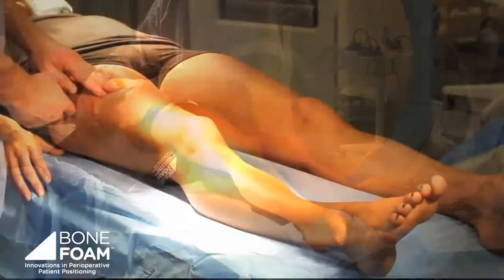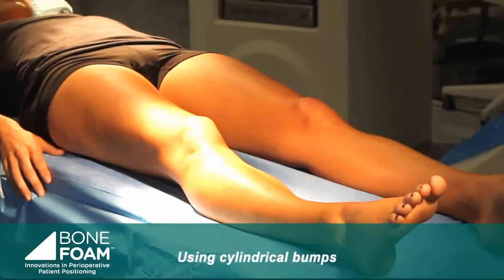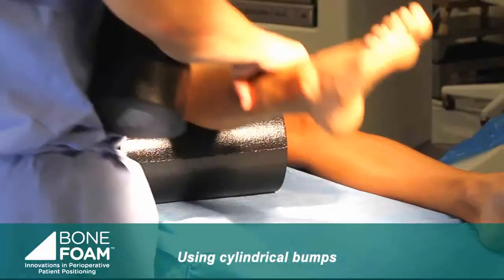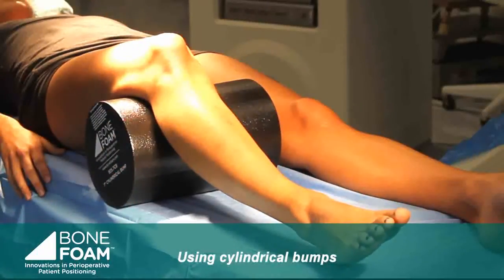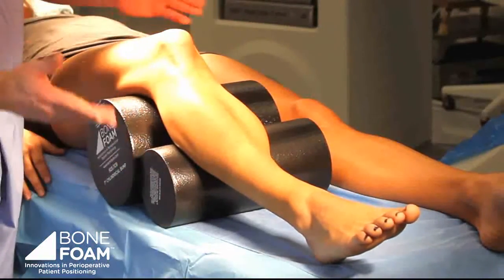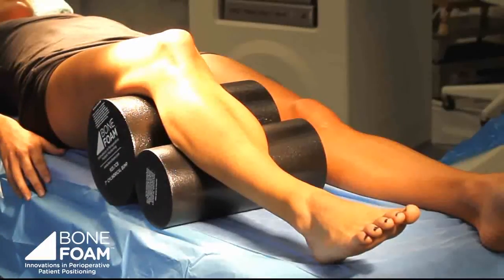If I want to bump the knee up with some flexion, as one might want to do for either a retrograde femoral nailing or perhaps a femoral plating procedure, there is a range of size in the bumps that we can use, so you can prop it under the leg like so. These can be used in combination. There are custom bags that can accommodate them, and you can see that depending on the size of the patient, you can use one, two, or all of these.